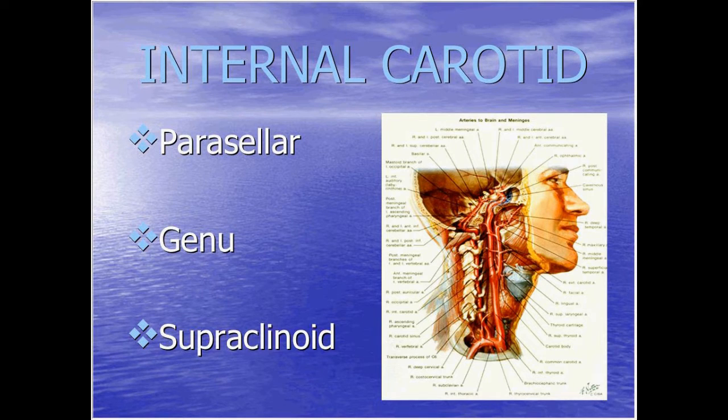Inferior. So we cannot directly. We can indirectly look at this vessel with the pulsatility index. If the pulsatility index is low, we know there's a problem down in this area here. But we can't directly look at this segment. So always remember that. If the doc says, can you find the petrous portion, just say, well, I can't, but I can give you the internal carotid artery siphon behind the eyeball. So you can look at the siphon, but you can't look at the petrous ICA.